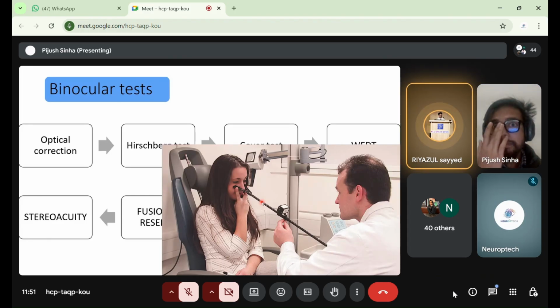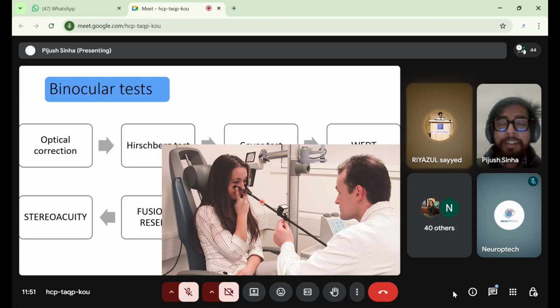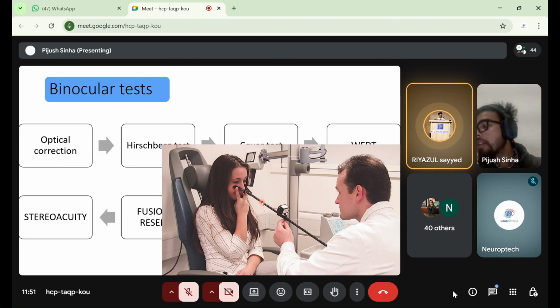I do not agree with your answer. Okay, so what did you say? So basically, the posterior surface is not directly measured, and the mechanism is simply that the image detects the air-tear film interface as the anterior boundary, like irregular breakup, uneven thickness, light scatter, incorrect anterior surface detection, edge localization error. So the effect on posterior elevation: because corneal thickness is calculated from the anterior and posterior surface by tracing pachymetry, it becomes an inaccurate posterior surface.